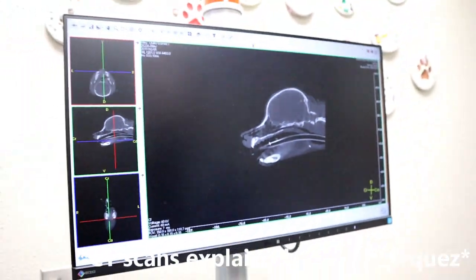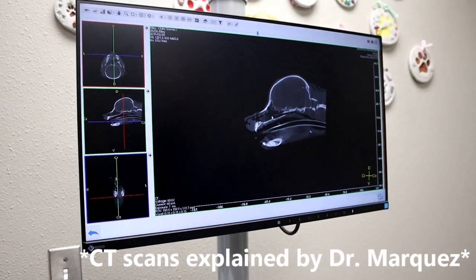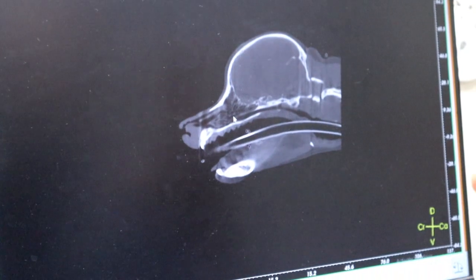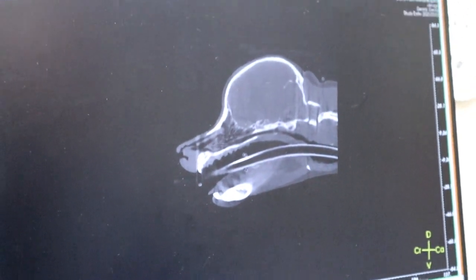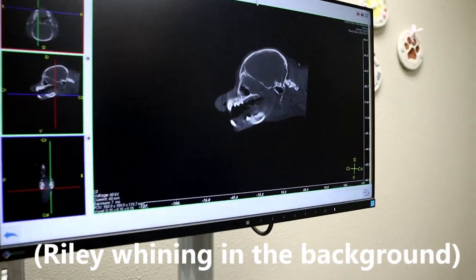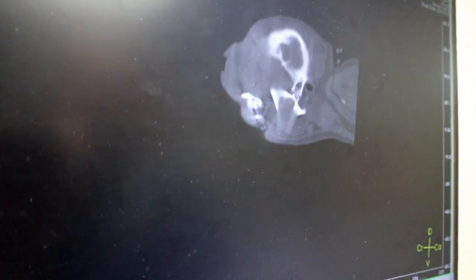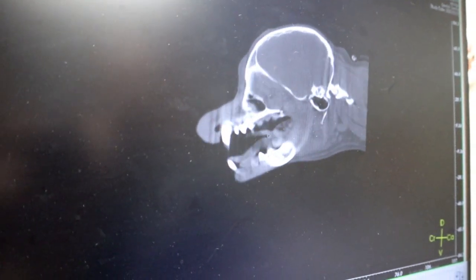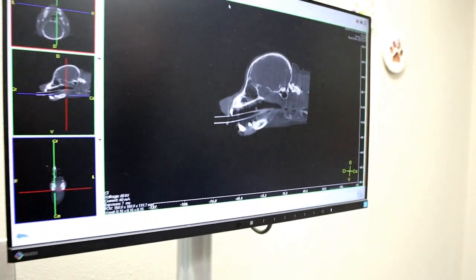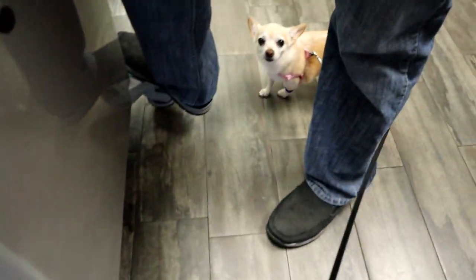So this is a CT scan, which essentially means there are about 750 x-rays all compiled into this. Every time we move this little cursor here, we're looking at a slice of each x-ray. What CT does is it allows us to see and reconstruct a three-dimensional model of whatever it is we're looking at — in this case, your little dog.